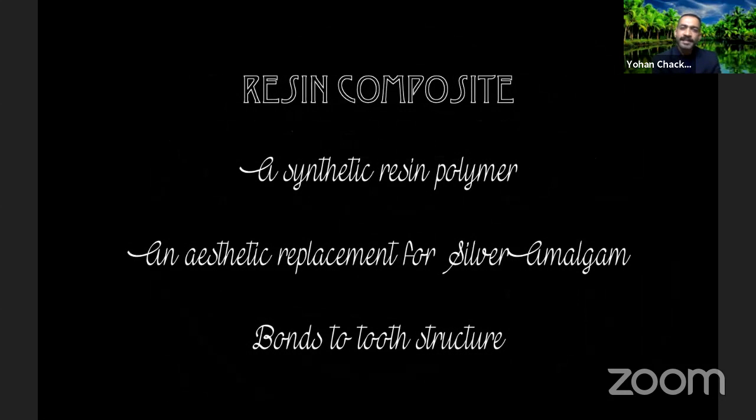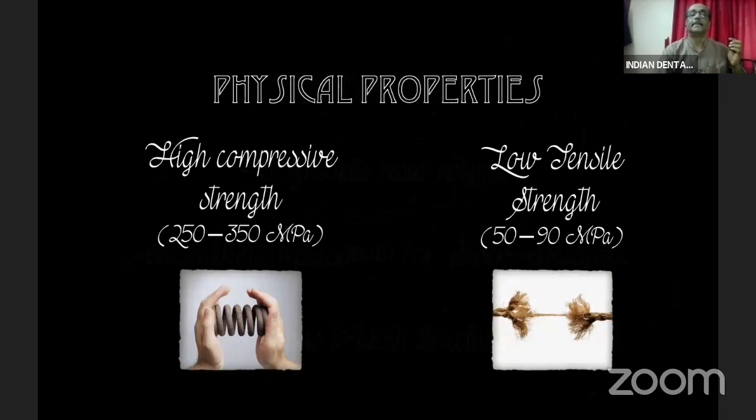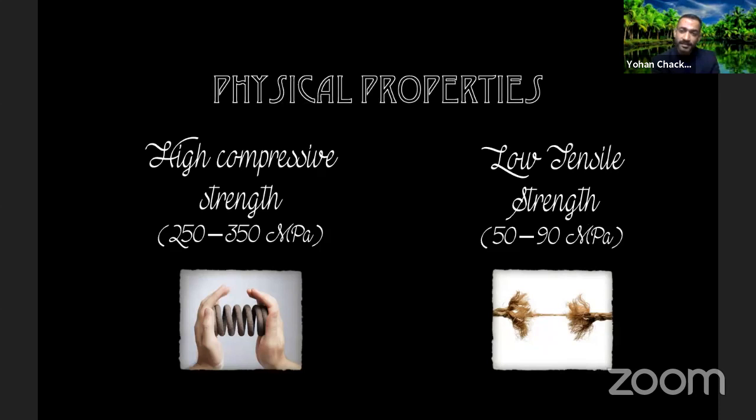So what exactly is a resin composite? In its simplest terms, it's a synthetic resin polymer, and it's become an aesthetic replacement for silver amalgam. And the reason why it has become a replacement for amalgam is because it bonds. This is the hallmark of the science behind it. Now let's look at the physical properties that we really don't look into much.